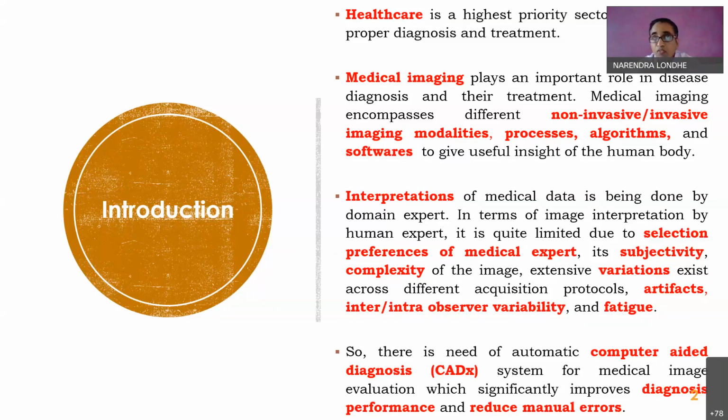And then there is also a problem of fatigue, because if you are seeing any one patient, and if you are doing some CT scan or some PET scan, or even ultrasound scanning, say intravascular ultrasound, 2500 images they create in one scan. Okay, or even more than that. So analyzing such a huge number of images for one patient, seeing every slice, every image, and getting an interpretation from those images is a tedious task, and that creates the fatigue.